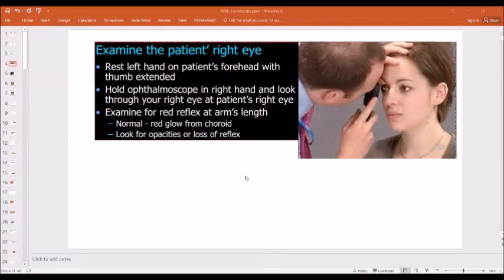First adjust your eye power with the lens, and it is advised that you look at your palm creases, because the palm creases have some similarities with the retinal vessels. So from the ophthalmoscope, look at your palm creases and roll your lenses to make the power appropriately focused so that you can see your palm creases. Then you may think that this focusing will be enough inside the eye of a person. Even then you have to move up and down with the lenses of the fundoscope. Anyway, then we have to go to check.